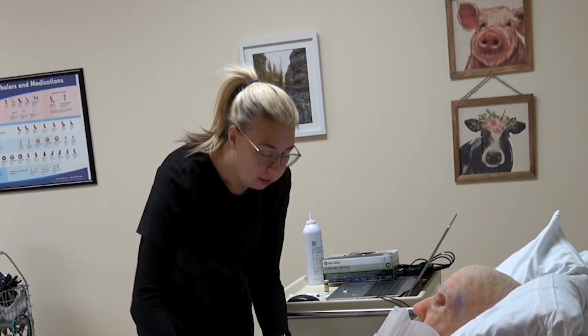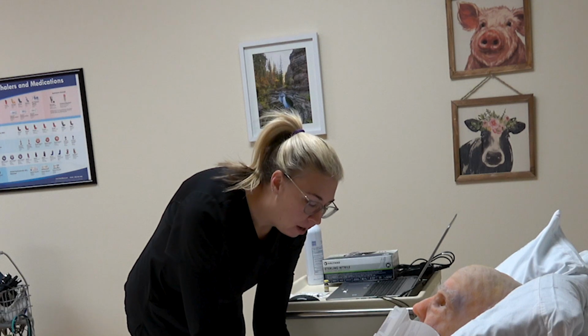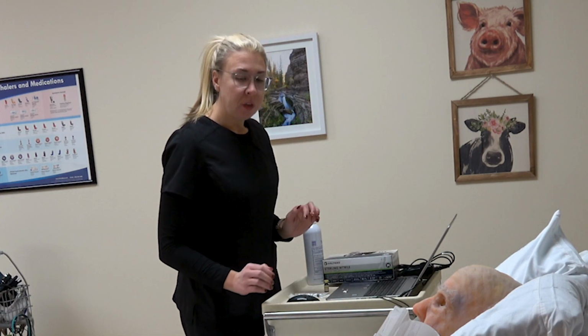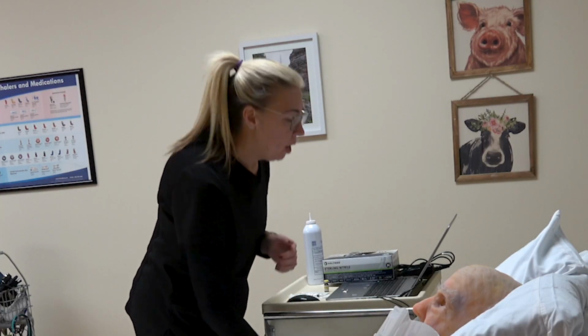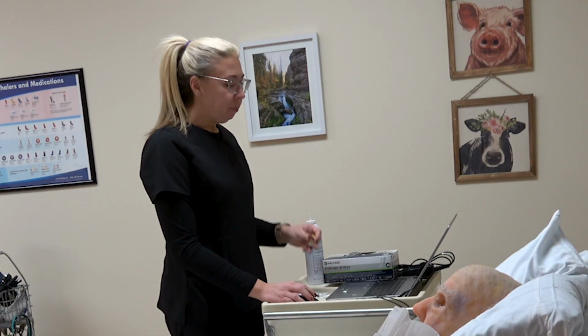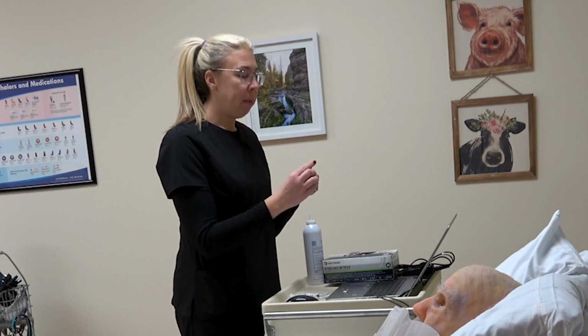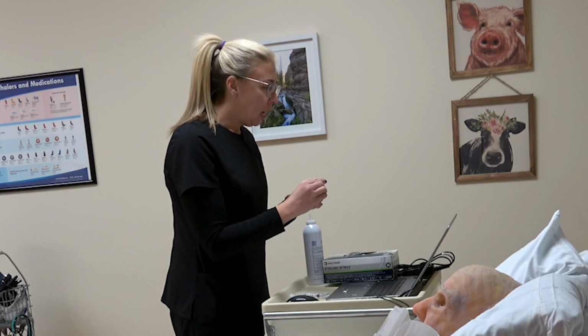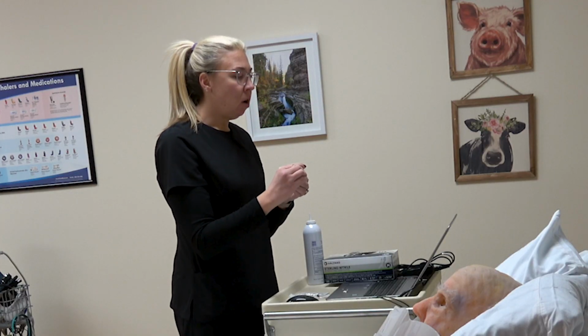Mr. Smith, can you verify your name and date of birth for me? And I'm going to verify that on his wristband as well as on our MAR that we have pulled up here. Perfect. Thank you so much. So now I'm looking at our MAR, and I'm going to do our third check with our medication against our MAR. So I'm going to look at the dose, the medication, the route, the time, make sure we're giving it correctly. So all of our 6 rights. So medication, dose, route, time, patient, and then at the end we're going to document.